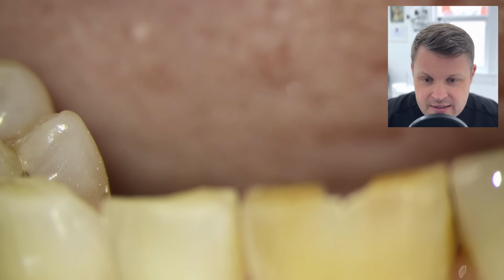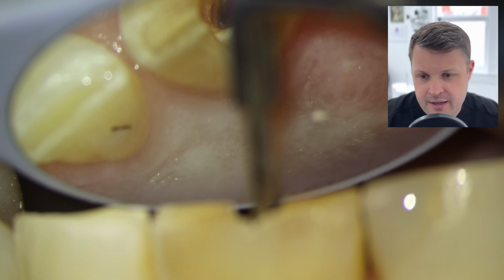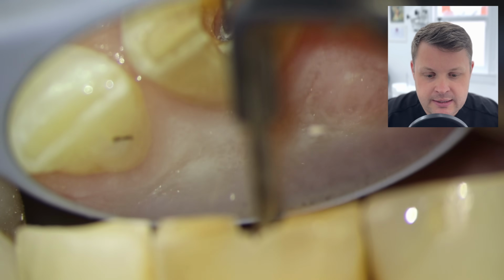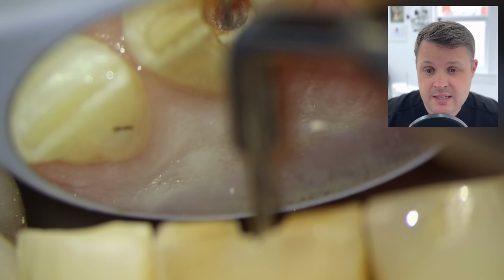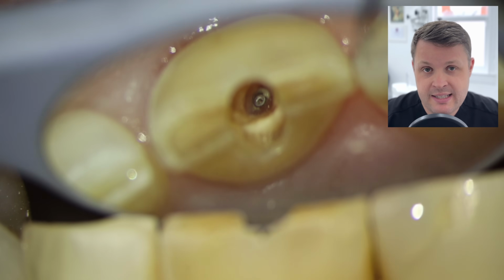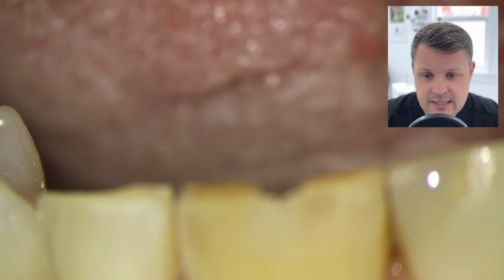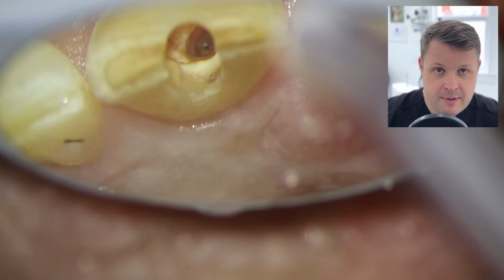But I'm going slightly deeper here again with our ultrasonics. I'm being very, very careful, and I'm super mindful of a perforation. And also what you've got to be careful with these needle-tipped ultrasonics is that you don't burn the tissue, and you don't put too much heat on these tips, because they fracture really easily when they've got a little bit of heat. And then we're just having a very judicious look with my ultrasonic tips, a little bit of cleaning, a little bit of a paper point, maybe a hand file, and just very gently moving further and further down.